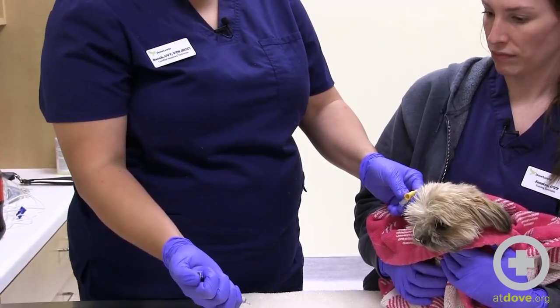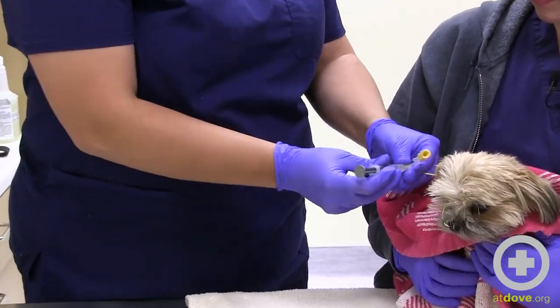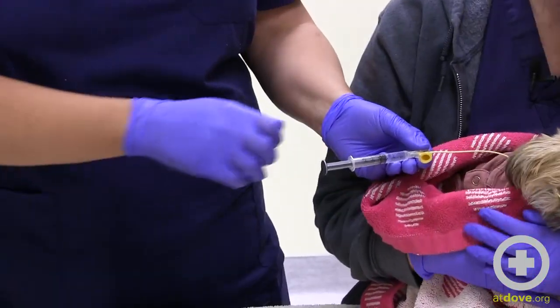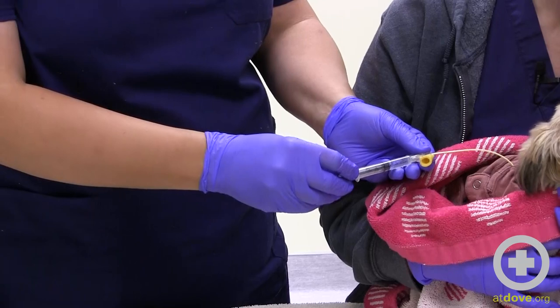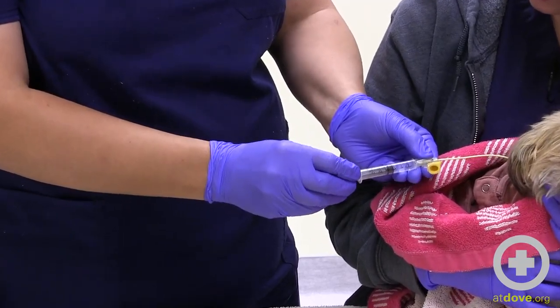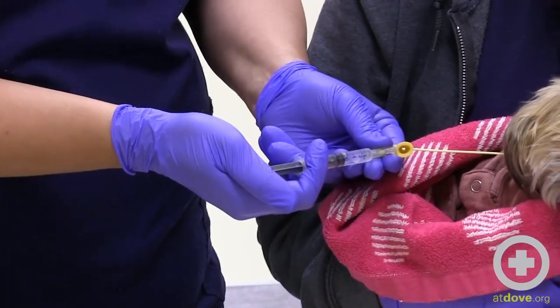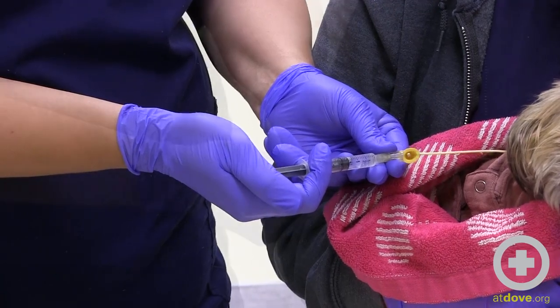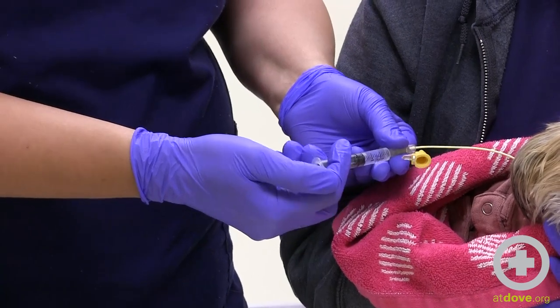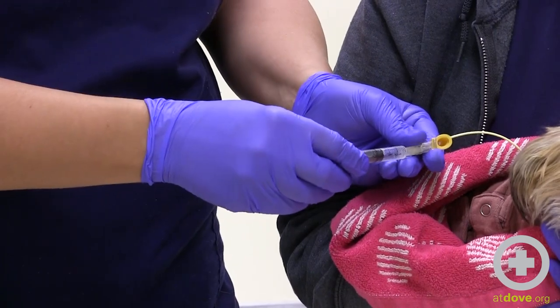I have quite a bit of tap water drawn up here, but I'm not going to use it all — I'm going to squirt a little bit out. I'll put it on the end of the tube and try to aspirate back to use negative pressure to pull out the clog. It doesn't really want to go, so I'll try to pulse tap water in. Her clog is pretty significant so I'm unable to pulse it through, but sometimes I would try that a little bit and then give it a break and come back.